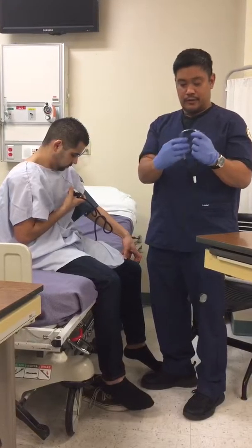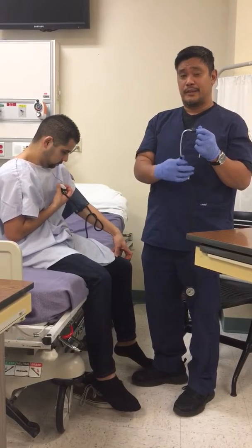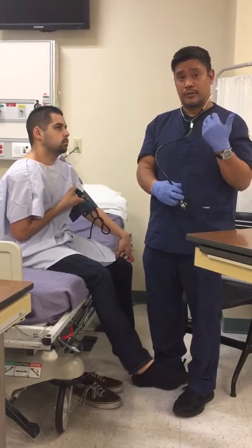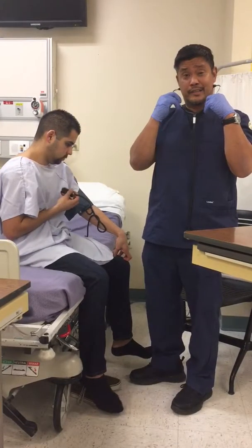Now, if the medication was a corticosteroid, like delivered through a DPI, I would have the patient rinse their mouth and spit to prevent oral thrush from occurring. In this case, it's albuterol, so it's not really indicated for this.